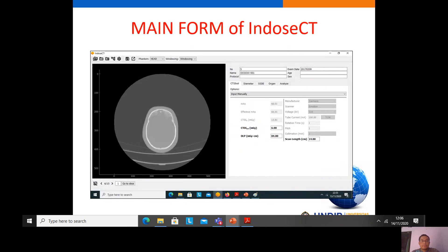This is the main form of IndusCT. IndusCT is for calculating the patient dose in terms of the SSDE. To calculate the SSDE, we need the CTDIvol (output dose) and diameter of the patient. IndusCT can also be used to estimate organ dose and to analyze patient dose.